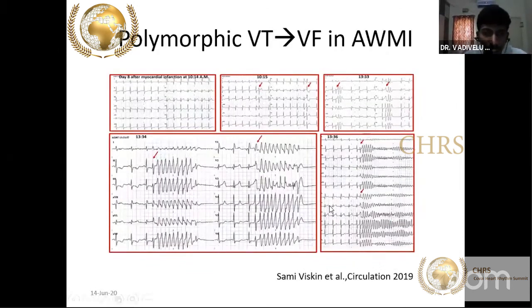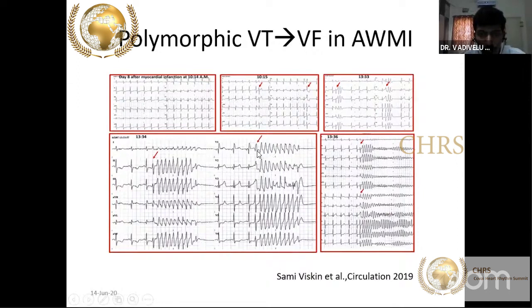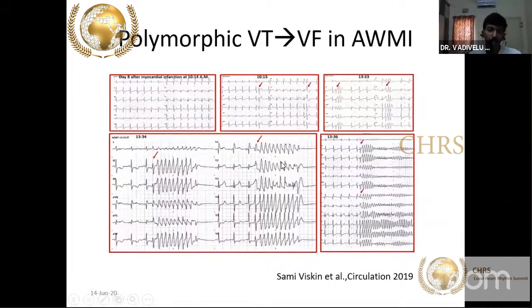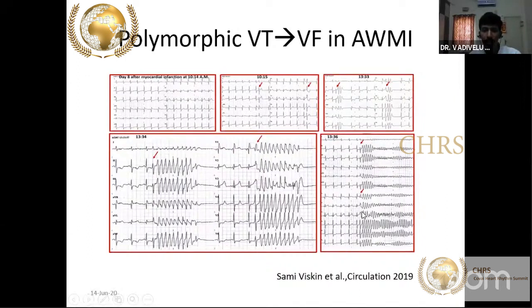A classical example from a circulation article: ST segment elevation in V1 and V2, followed by a VPC falling on the T wave. When the myocardium is ischemic and a depolarization event falls into the repolarization zone, this is the R-on-T phenomenon — triggering polymorphic VT and then ventricular fibrillation. This is one of the most common causes of sudden cardiac death in anterior wall MI and acute STEMI.